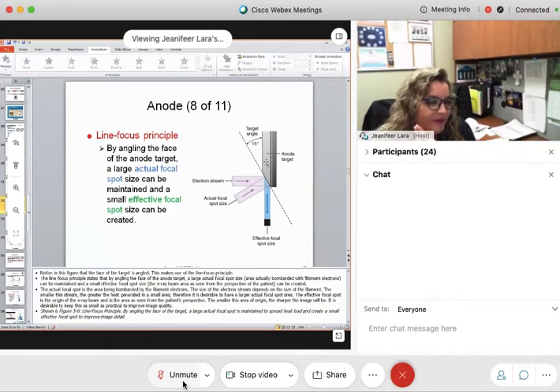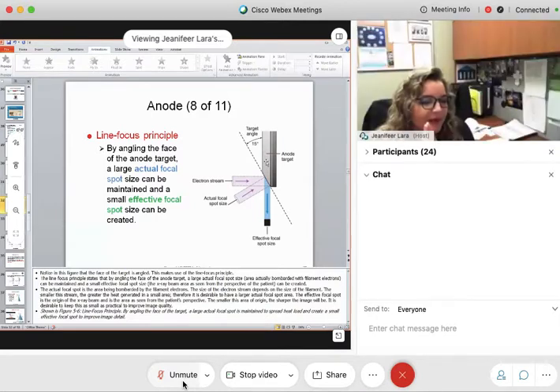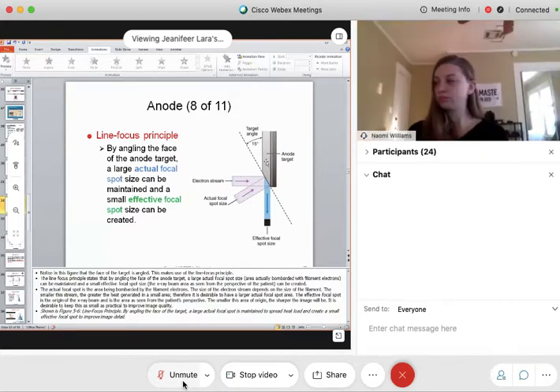Got it. It's 2 words. We just said it. We talked about what it was made of. Tungsten? It is made of tungsten, but what is made of tungsten? What did you say, Naomi? The focal. The focal track.